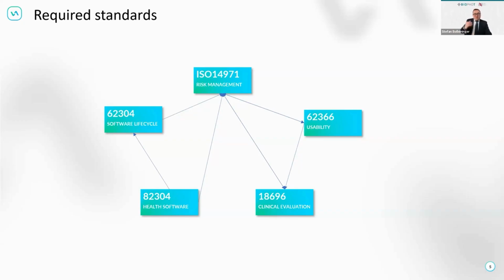However, if you say to them, okay, this is now your state, you are compared to your age group, 40 to 50 years old persons, you are compared in the following criteria, that's not yet a medical device. But if you now say you are in that category, however, and also that category has the following risk of a disease XYZ, then it creates a prediction score, and then it makes it a medical device, not taking into account the education of the patient.